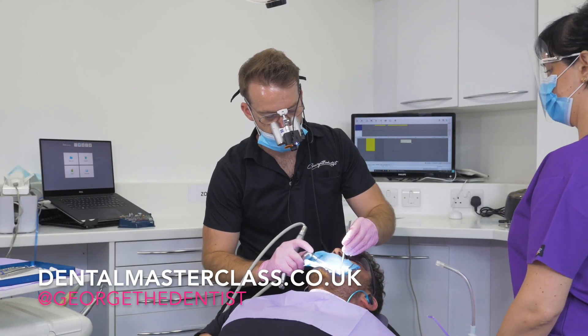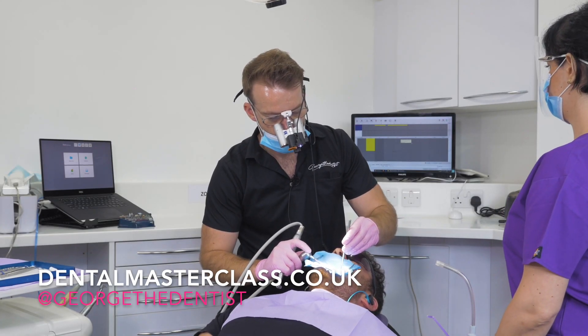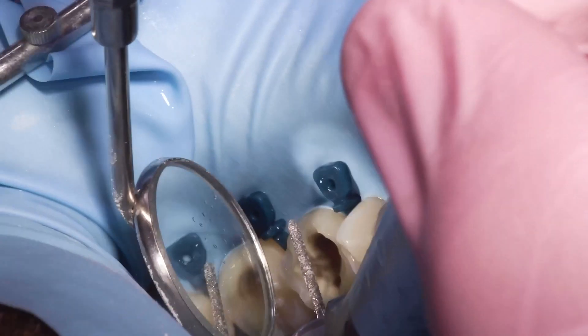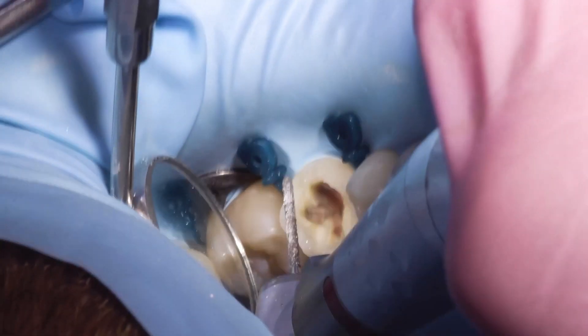I've done the majority of my occlusal reduction. When I do the occlusal reduction I'll make sure that I go as close into proximally as I can, but not quite going into proximally there. So after I've done this I'll do my interproximal areas.